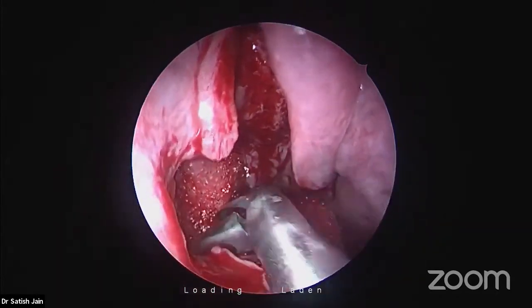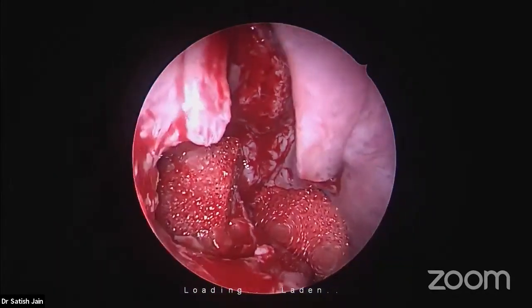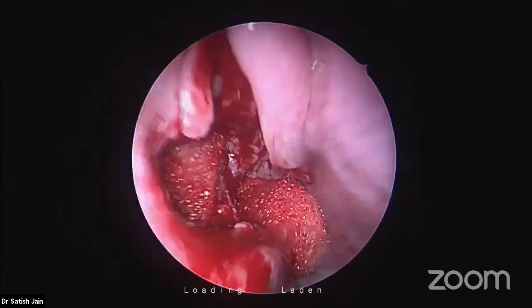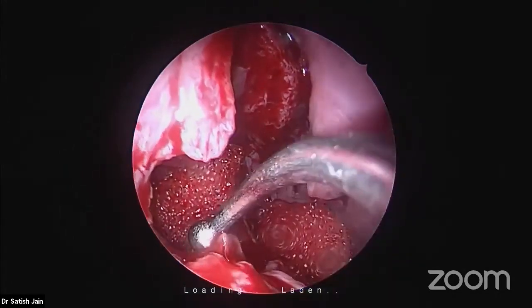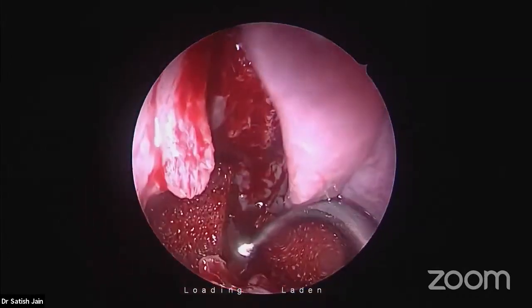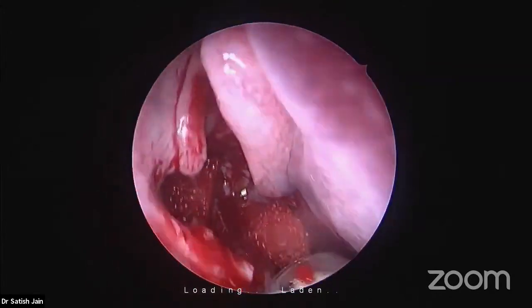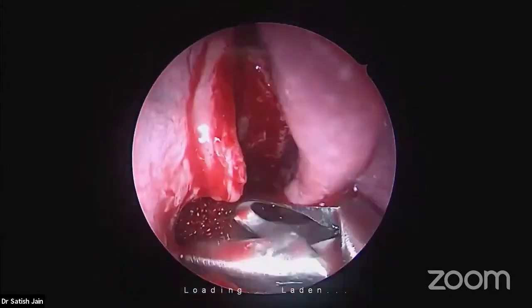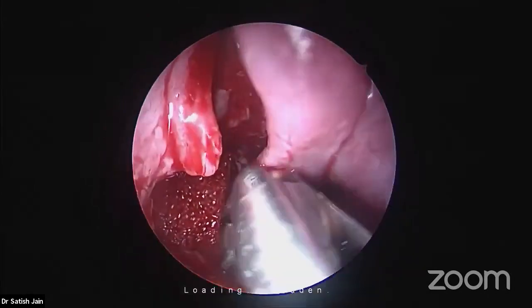One more question, sir. When you are approaching the maxillary sinus, please enlighten us how to approach anterolaterally and what could be the possibility to reach there. That's a different, great question. Again, I tell you, instruments. To reach anterolaterally, first of all, you can use your 70-degree and your angled instrument, but sometimes it is not all that easy and still it doesn't give that much access.